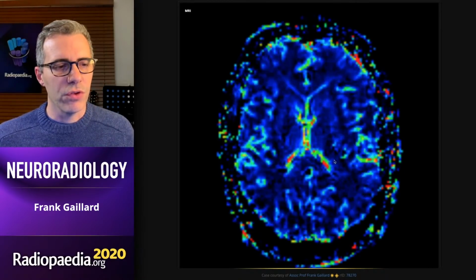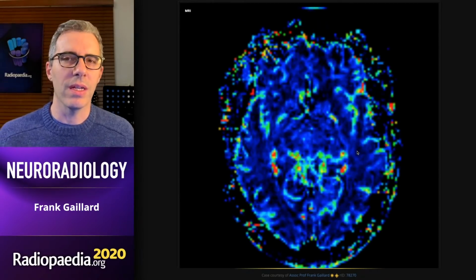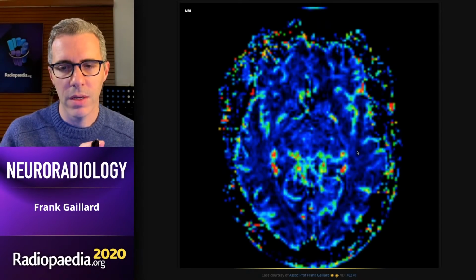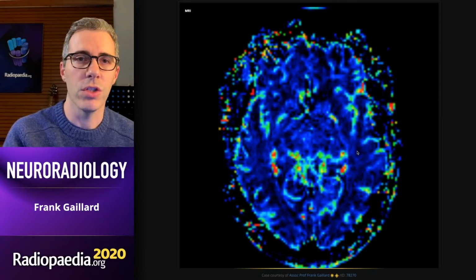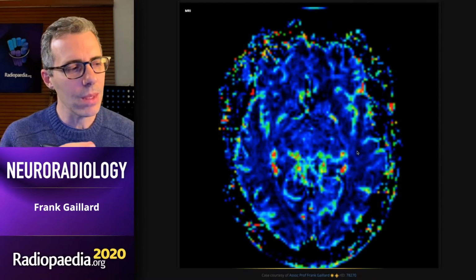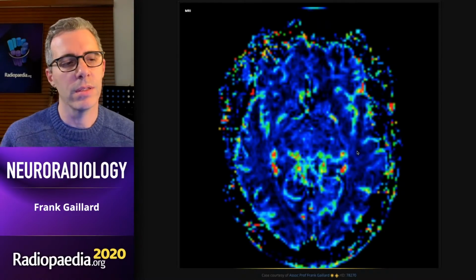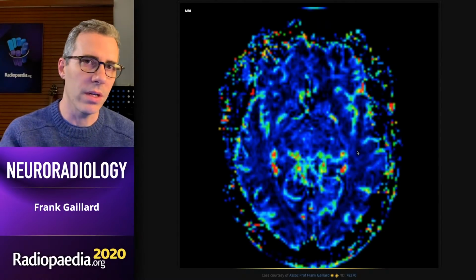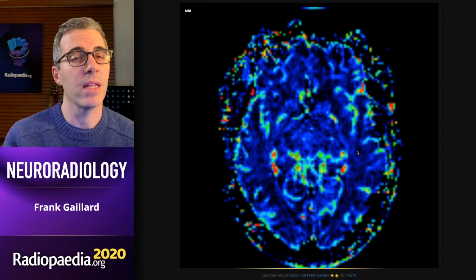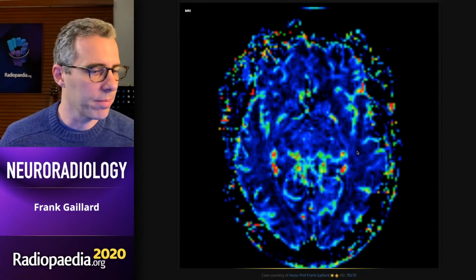When we look at the perfusion, you can see those are prominent vessels going down, but there's no real solid elevated area of CBV. One thing just to be wary of: if you've got oligodendroglioma histology, which can have this chicken wire or staghorn vascularity, that can elevate your cerebral blood volume without it meaning that it's a high grade. So just be aware of that. If you think it's an oligodendroglioma and you see elevated CBV, it doesn't necessarily mean that you're looking at an anaplastic oligodendroglioma. It just might have prominent oligodendroglioma vascularity.